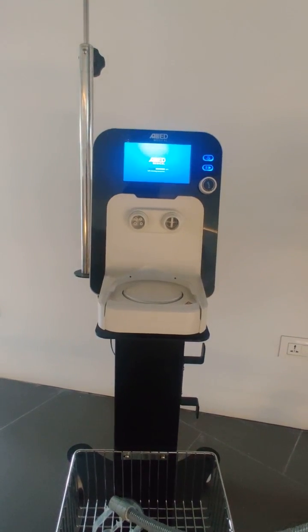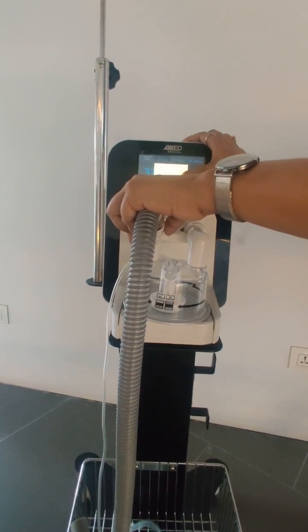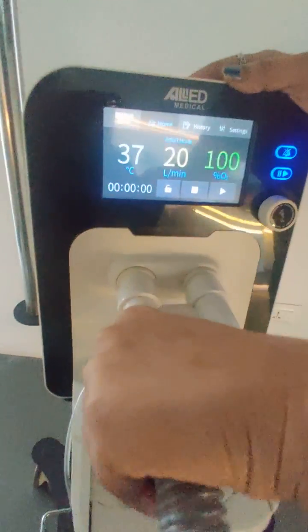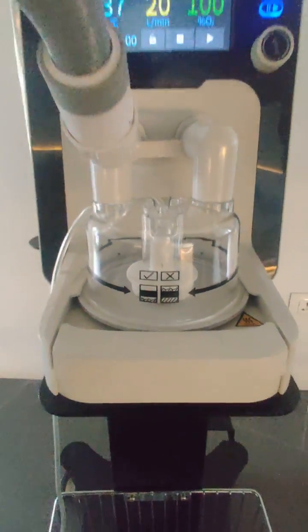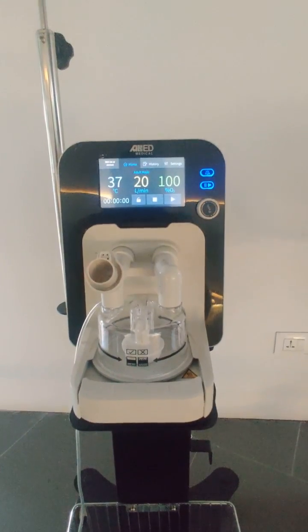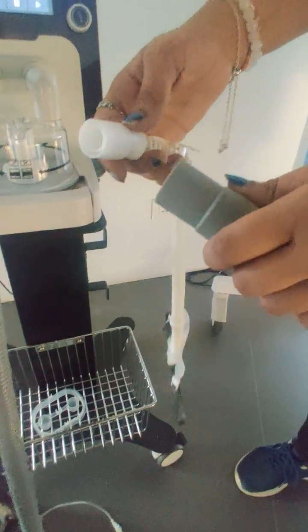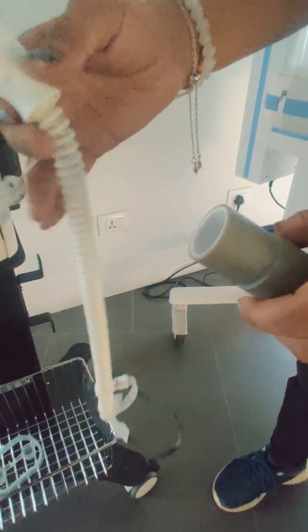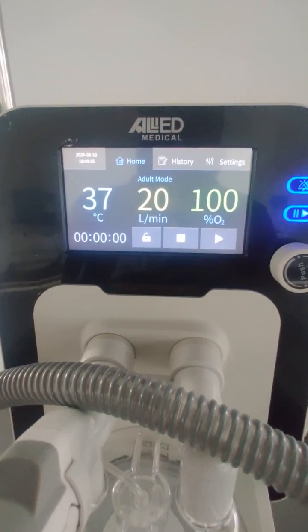On the front side we connect the humidifier chamber. This HFT device has a built-in humidifier with servo control — you can set the temperature via the touchscreen. The humidifier chamber locks into place at the bottom. The circuit tubing connects to the machine and its other end connects to the nasal prongs — the HFNC cannula.